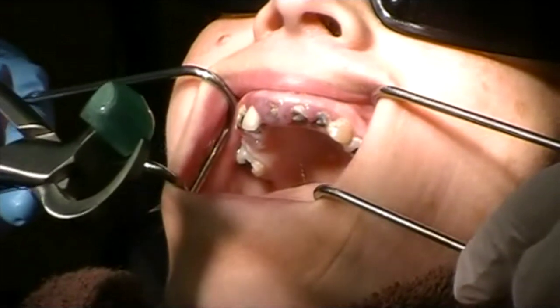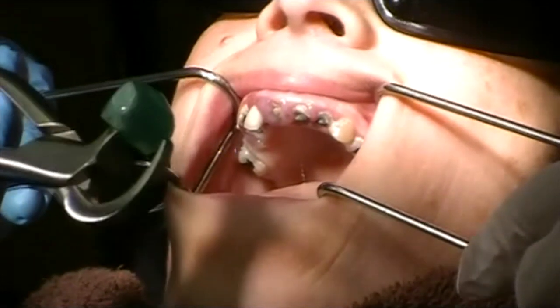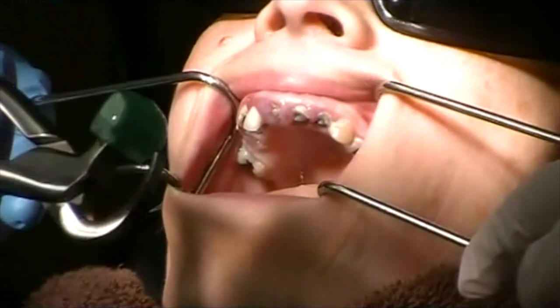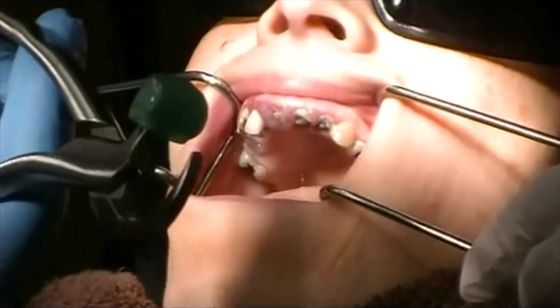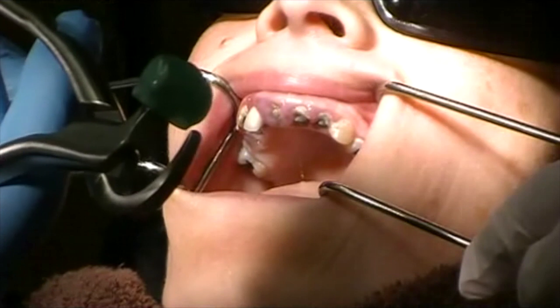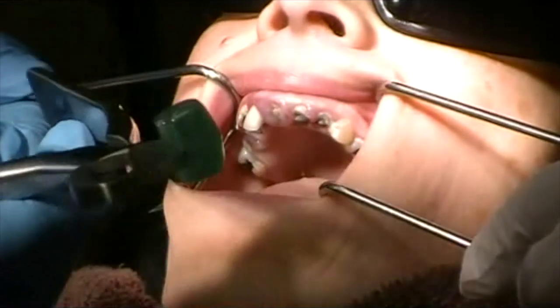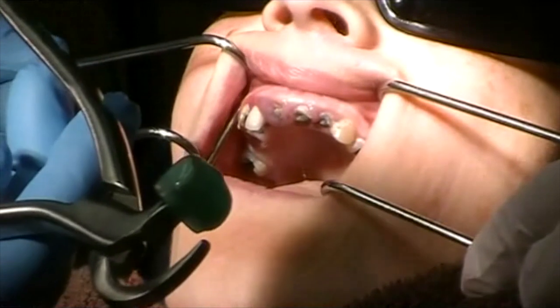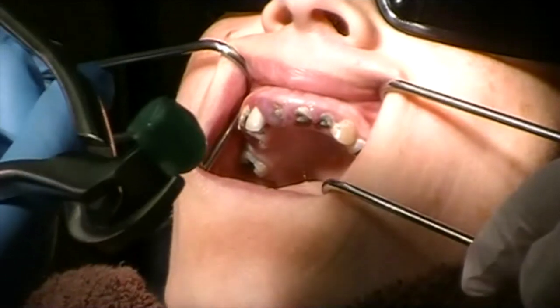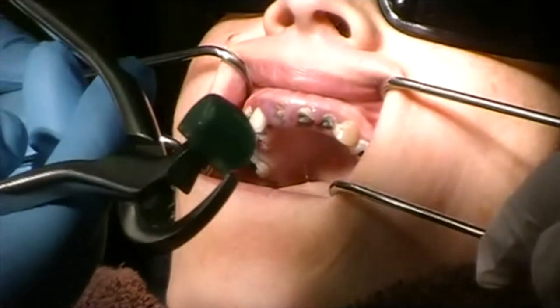We also have a universal mandibular physics forceps. For third molar extractions they also have another set of third molar physics forceps, but we probably won't use those today. The forceps has a metal end that's squared off, which is why I want to flatten the palatal surface of each root to develop a purchase point. We have a bumper that will fit onto the facial bone as far apical into the vestibule as possible.